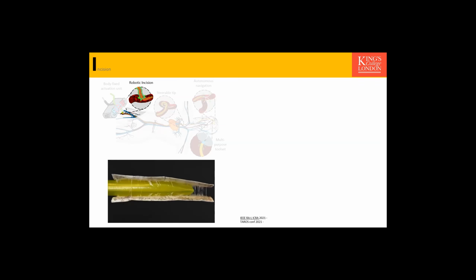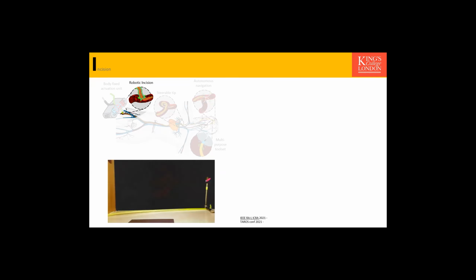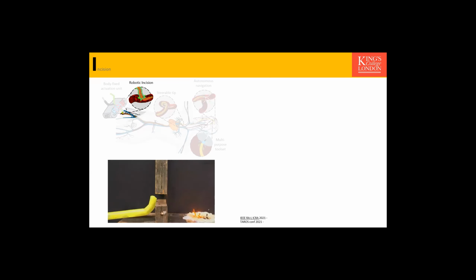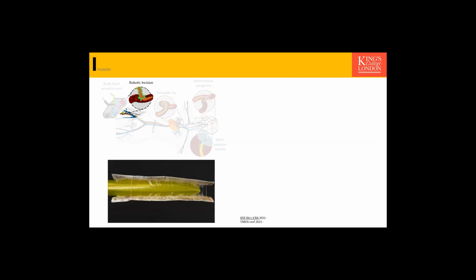For those of you who don't know what a growing robot is, this is basically an everted plastic sheet, which is everted from outside to inside, and by pressurizing this sheet, it everts out. The part that's inside everts out. Why do we call it growing? Because the part that's deployed in the environment remains stationary, and we have additional material at the tip of the robot. So it's kind of like growing.